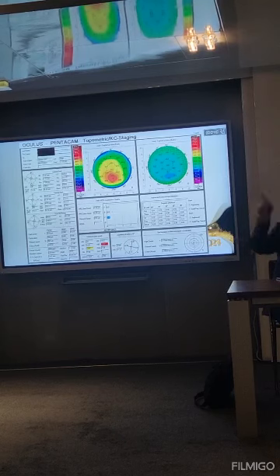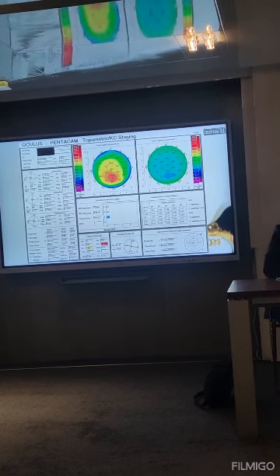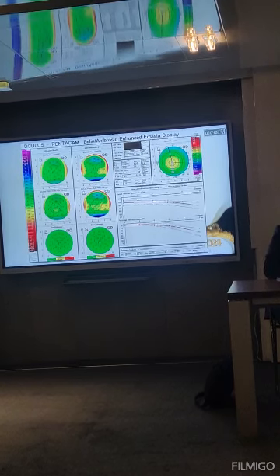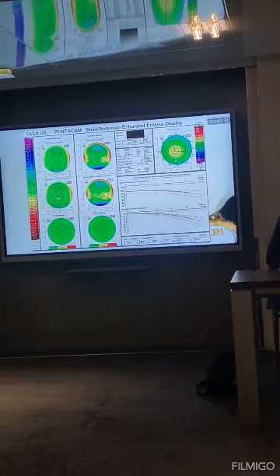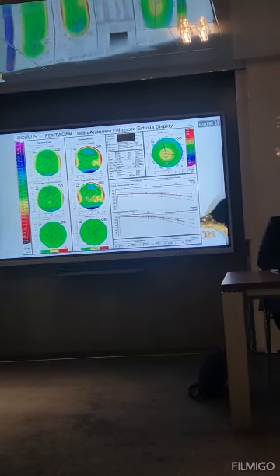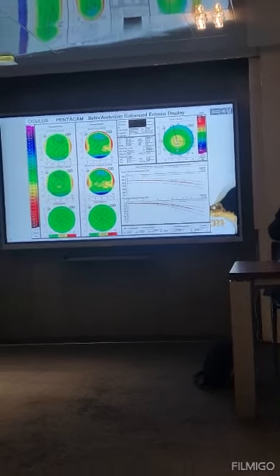Okay, for example, this is the topometric indices, and here's the BAD. BAD is very promising, isn't it? It's perfect. Yes. Now, do they have epithelial mapping for it? Yes. Well, I'll keep it to the last, okay? Okay.